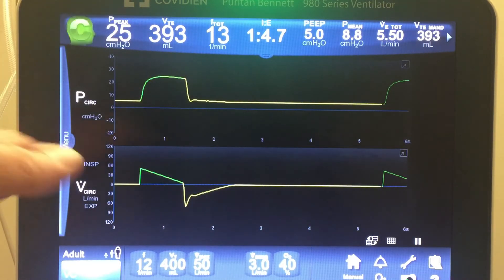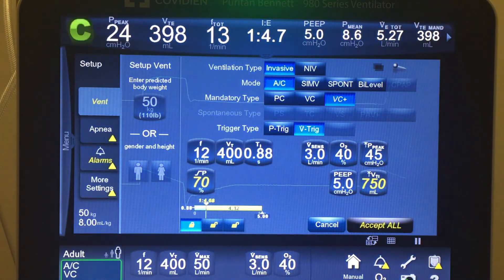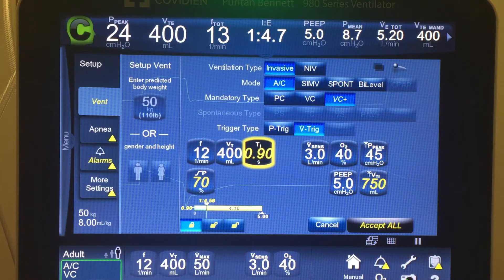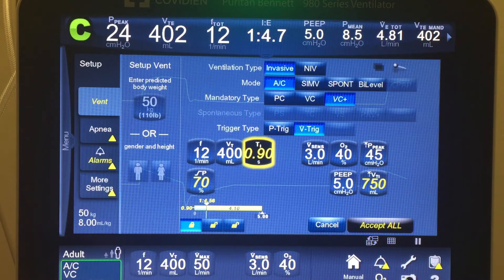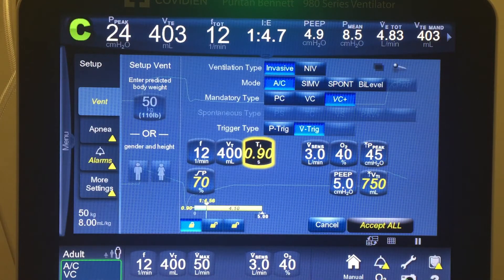That particular dip pattern doesn't happen very often — most of the time if somebody's air hungry they're really scooping the waveform out. Now let's flip over to VC Plus. Notice that peak flow is now replaced with inspiratory time. Everything else looks pretty much the same, but how it reads and delivers is completely different — that's where the differences between VC and VC Plus come in.